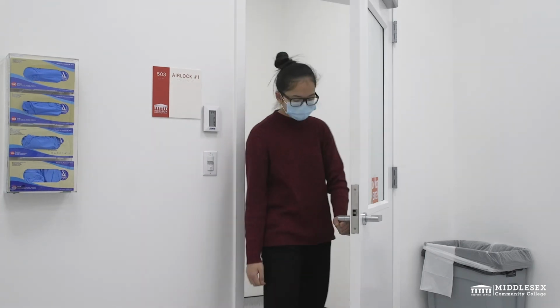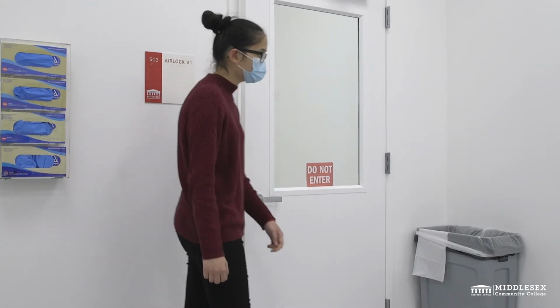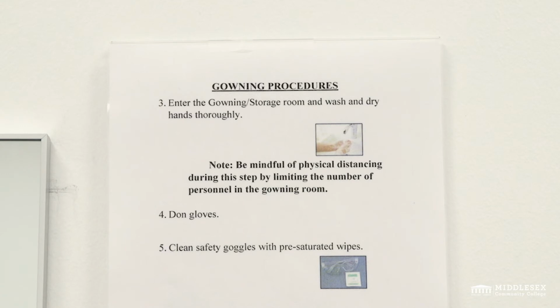Once you have entered the gowning/storage room, locate the instructions on the wall for next steps. The first step requires you to wash and dry your hands thoroughly.